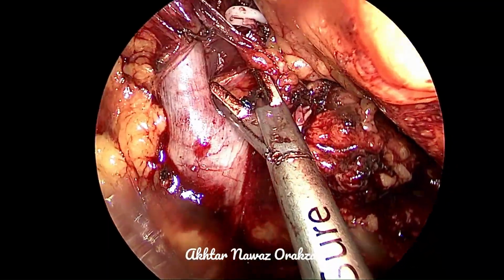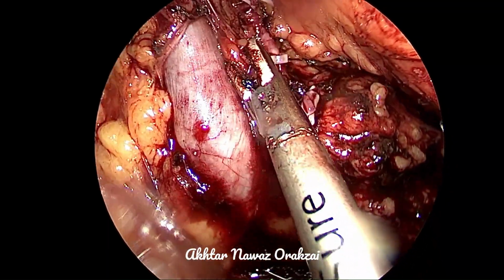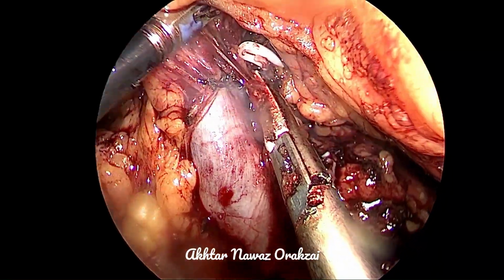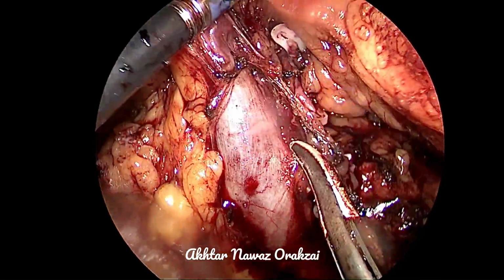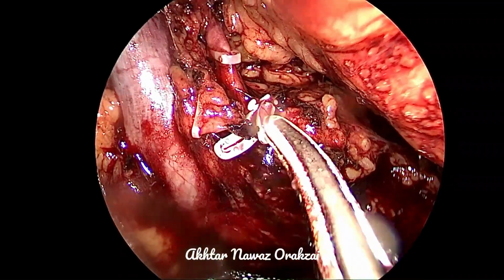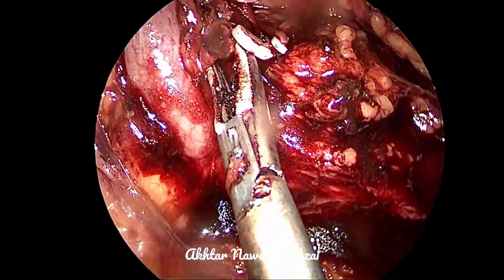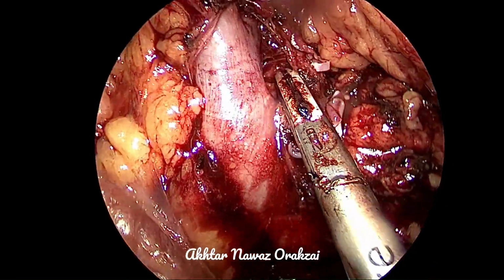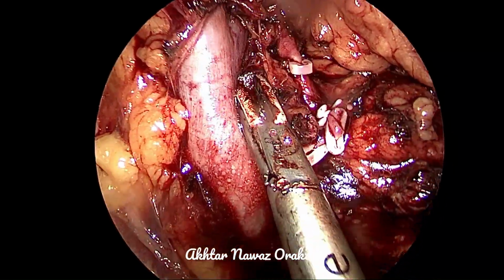So we are looking for that branch, the second one. As you can see, the vein is already quite full with blood. If it was the main artery, it should have collapsed. So we are looking for another artery here.